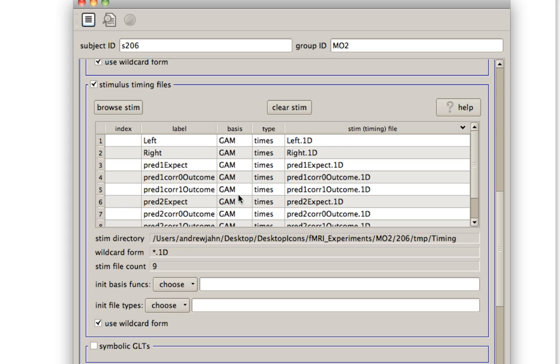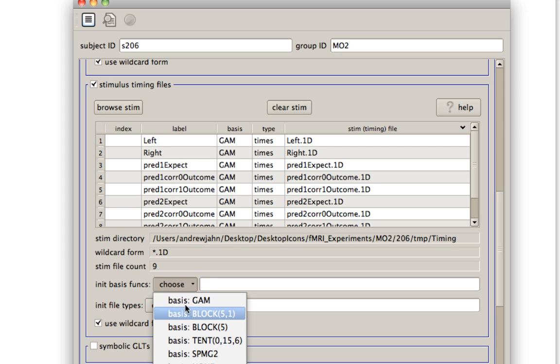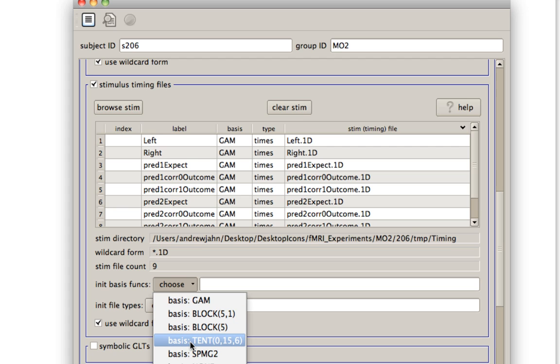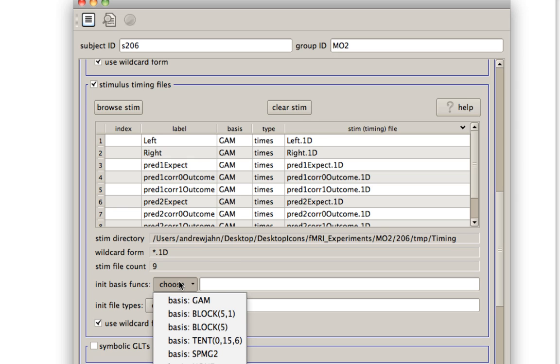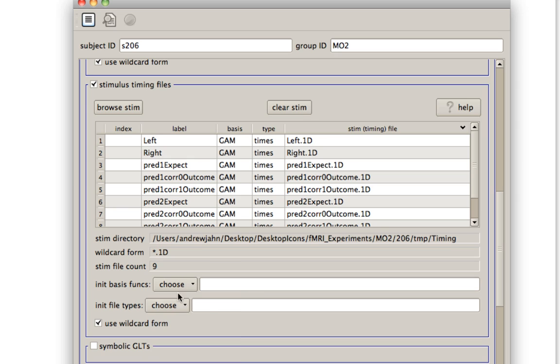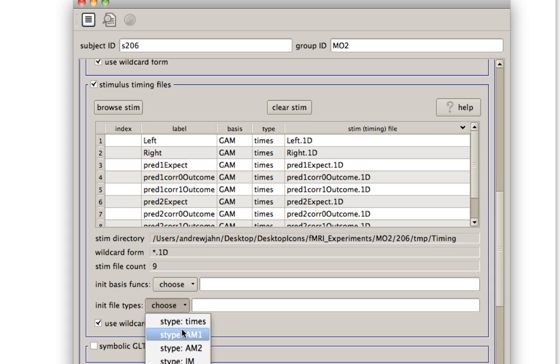Basis functions and the stimulus type is fine. But if you want to use something like a block, in other words, a boxcar function, or a tent function, or SPM's time derivative function, you can use those as well. Likewise, if you have more than one parametric modulator, you can use AFNI's AM2 file type.